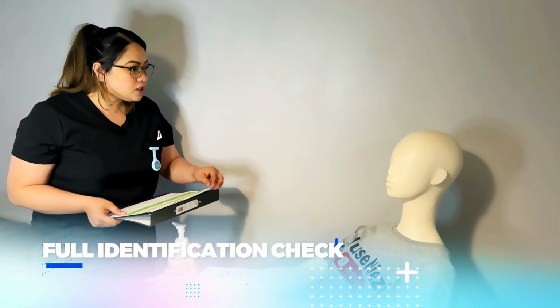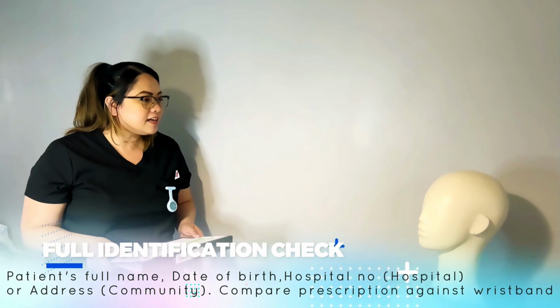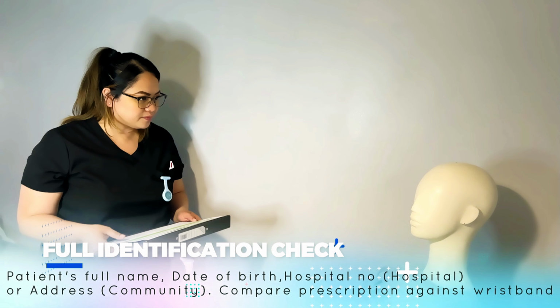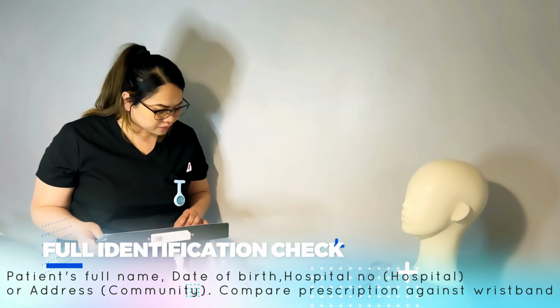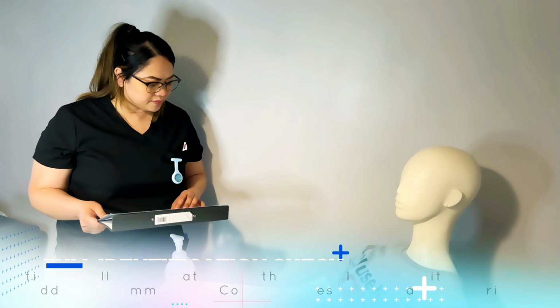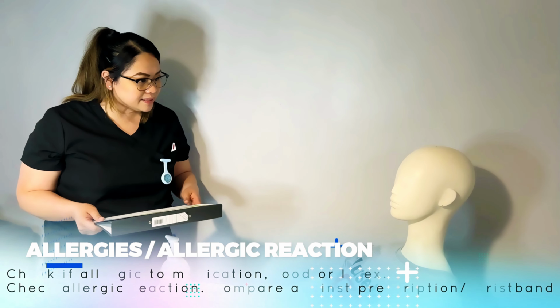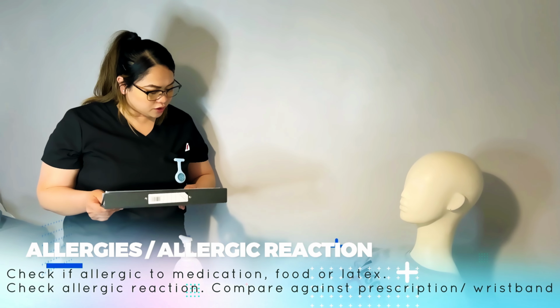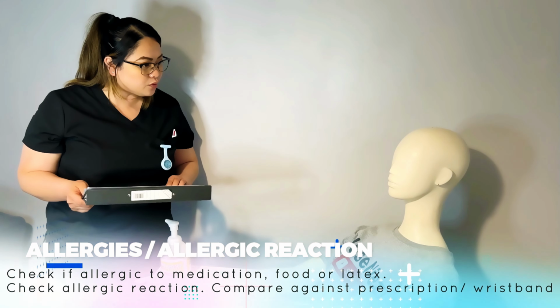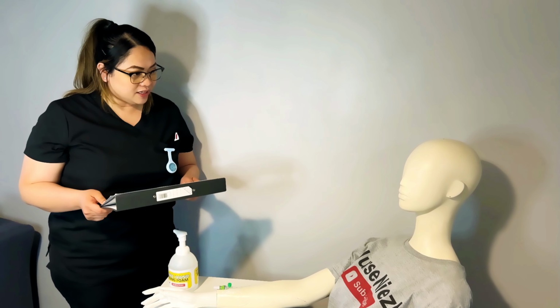Yep. Okay. Would it be okay if I just do an identification check? Can you tell me your full name, please? Lylene Consi. Okay, Lylene Consi, according to my prescription. Can you tell me your date of birth? 10 of the 1st, 1987. Okay. And your address, please? 1000 Edinburgh Avenue, NR3 17HA. Okay, do you have any allergies to medication, food, and latex? I'm allergic to penicillin. Penicillin, okay? According to your prescription, you're allergic to penicillin. Can you just tell me the allergic reaction that you get from penicillin? I got rashes. Rashes. I'll make sure that I won't give any penicillin derivative, okay?